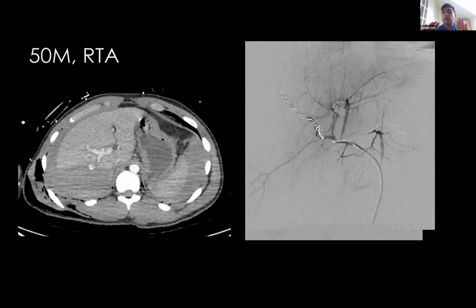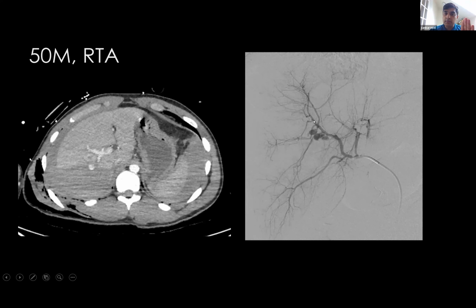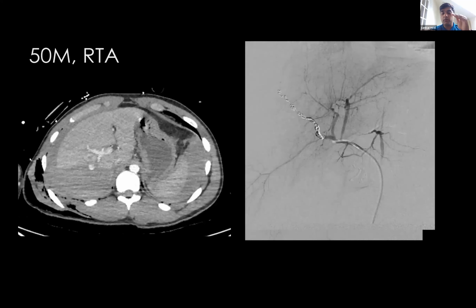And in essence, what we've done here is taken it out from the proximal bit all the way across and made sure that even the distal bit is covered. Now, this is a method of embolization which we call backdoor and front door. A lot of times people do not do backdoor for livers, but in our experience, we figured out that backdoor embolization is paramount for livers as well, because there's a collateral circulation that can come from the other end.